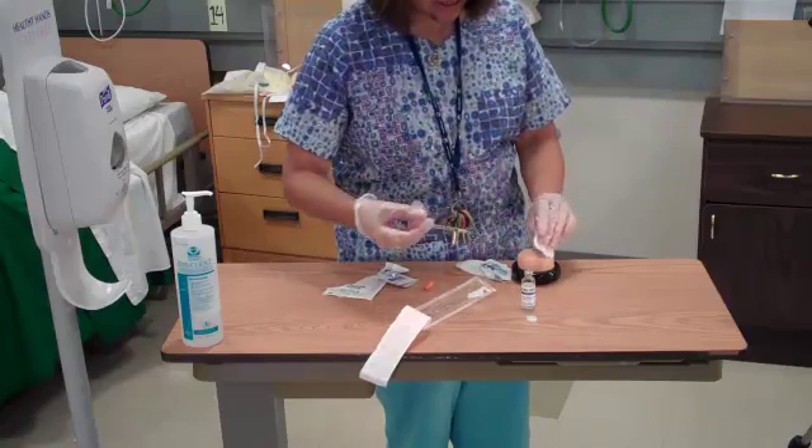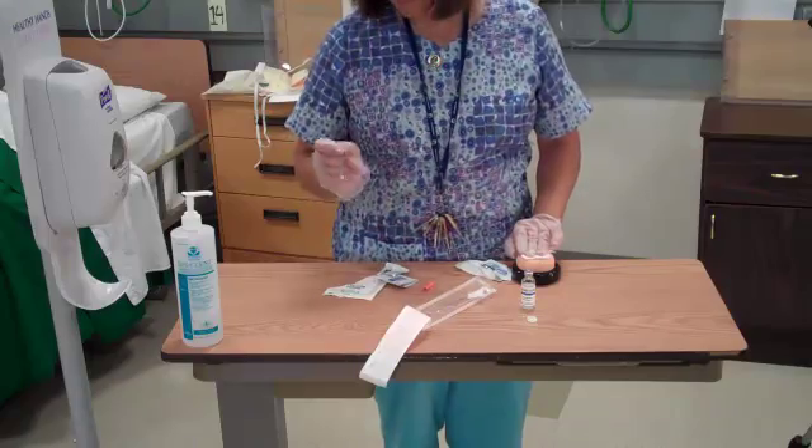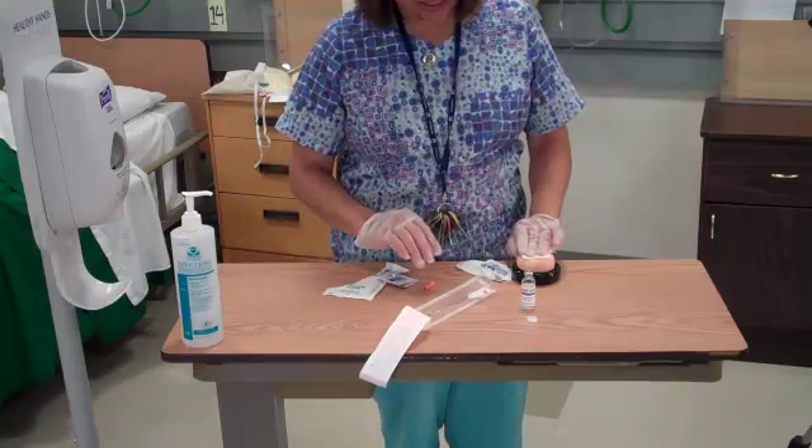I'll go ahead and take the needle out, cover it with a 2x2, retract the needle — this one retracts by pushing in the plunger — and dispose of that in a sharps container.